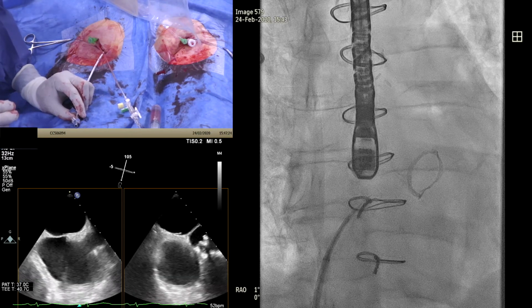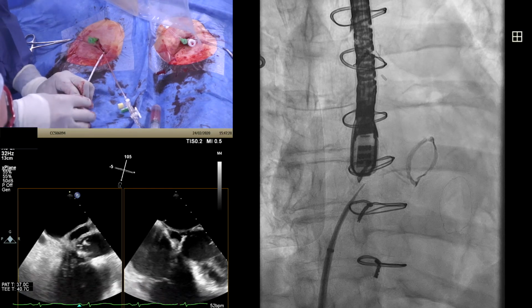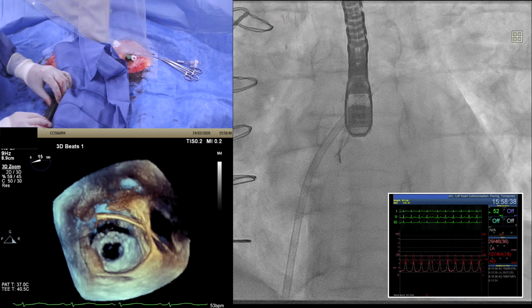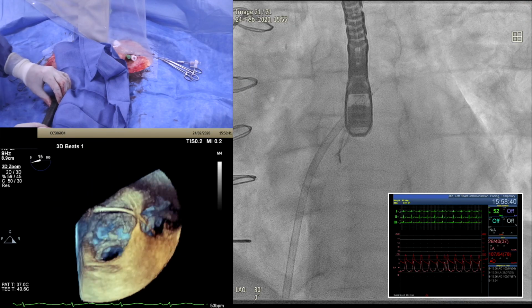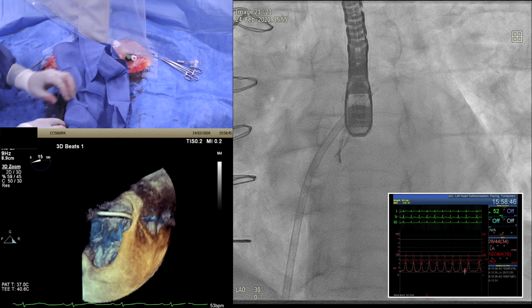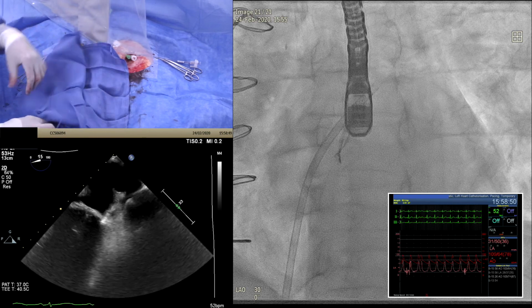It looks as though it should be through, but it hasn't quite moved in the way that I want it to. It does look as though it's gone through. So I think I'm now miles away from the aneurysm. If you can just make sure I'm not poking the aneurysm. No, you're not. You're quite above it. Great. You're near the vein now, the pulmonary vein. I don't know whether that's fine. Okay, actually you're in it, but I'm going to leave that there.